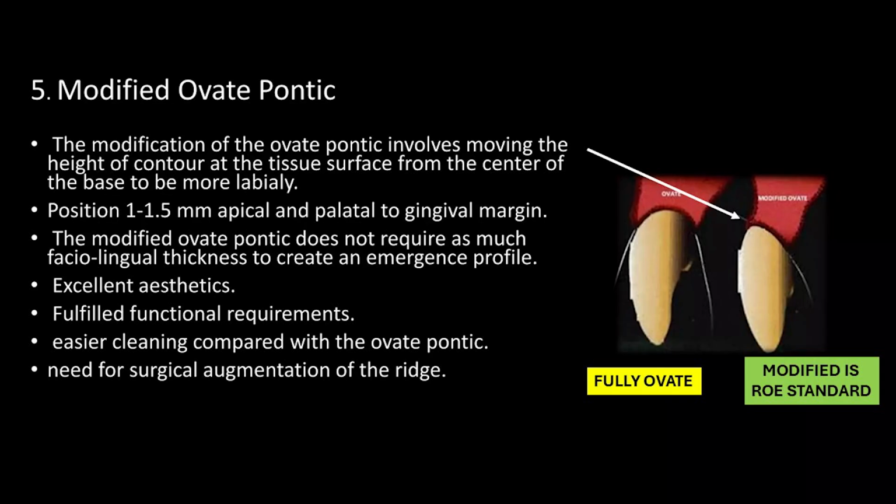All right, modified ovate Pontic, which is this. This is our standard here in green. In the front, in the anterior part on the facial side, we're down into the gums a little bit, and we follow the contour of the ridge, and we don't have any kind of an overlap on the ridge. This is fully ovate, and you can see the difference. This is cleansable, this is more cleansable.